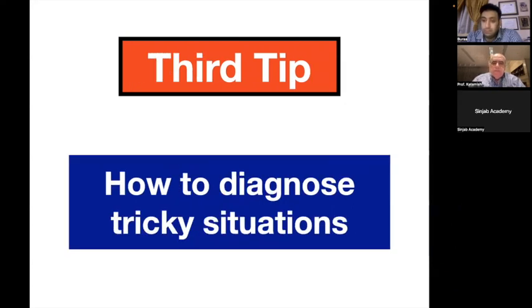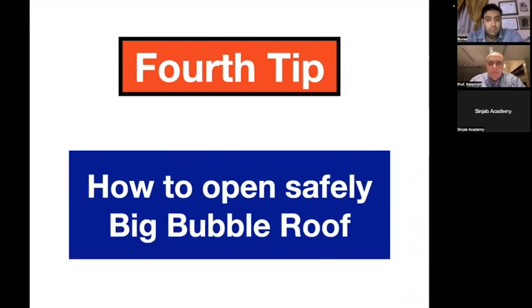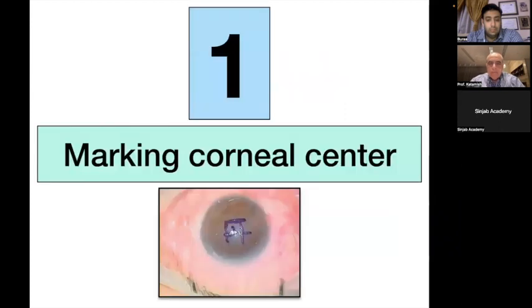The third group of tips, you have to diagnose some tricky situations. I will mention it in the proper time during my lecture. And the fourth group of tips, you have to open safely the big bubble roof. So I will go through the operation step by step, and I will mention tips along the way.